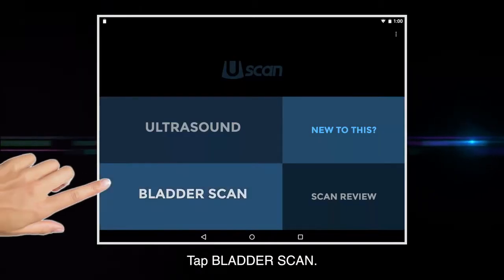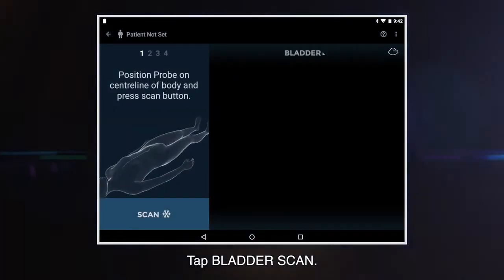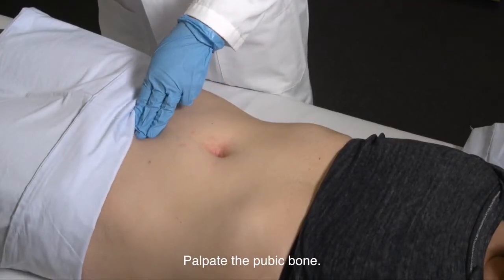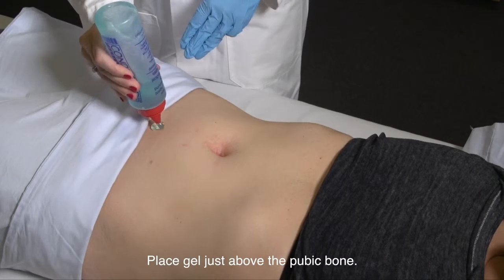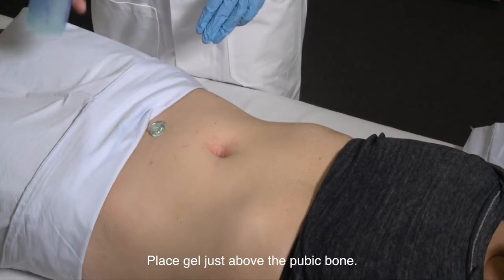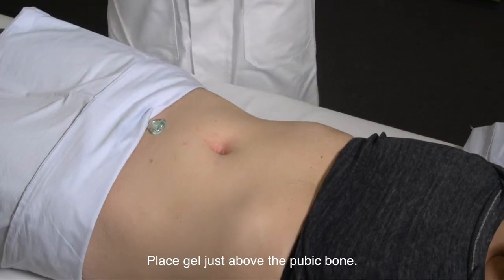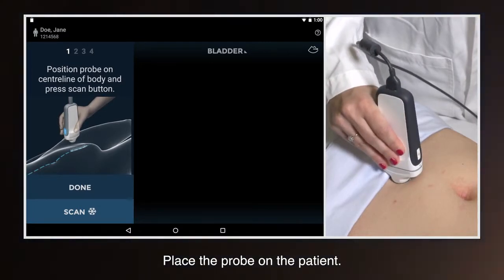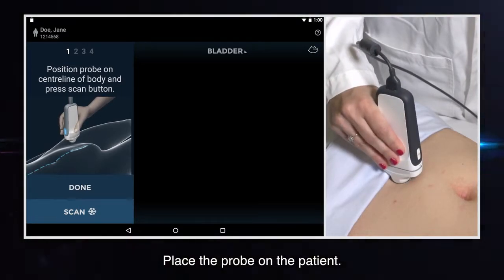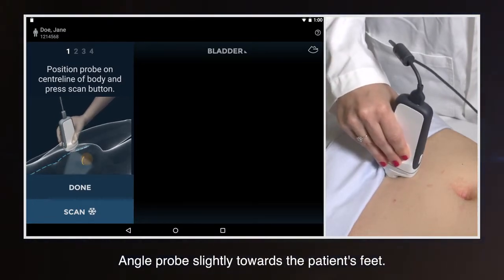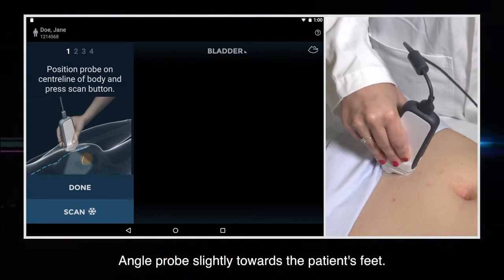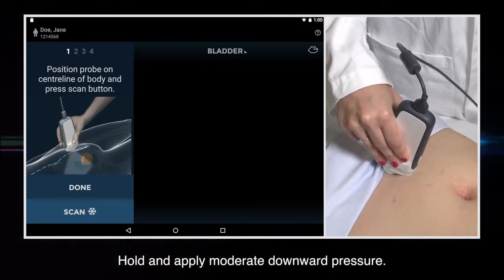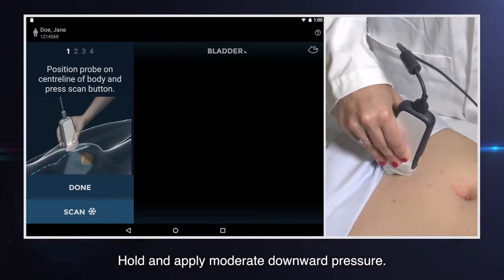Tap bladder scan to start the bladder measurement sequence. Palpate the pubic bone and place gel just above the pubic bone. Place the probe onto the patient with the button towards the patient's head. Angle the probe slightly towards the patient's feet. Hold the probe as shown and apply moderate downward pressure.